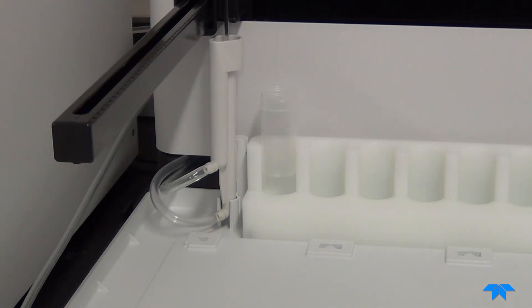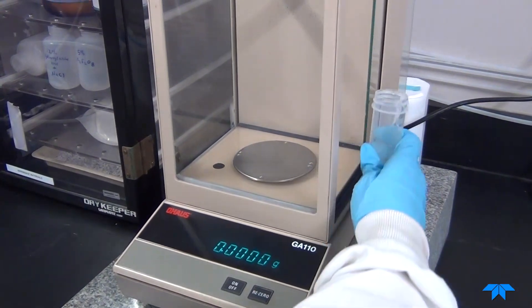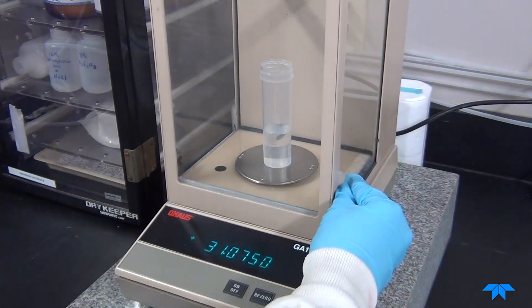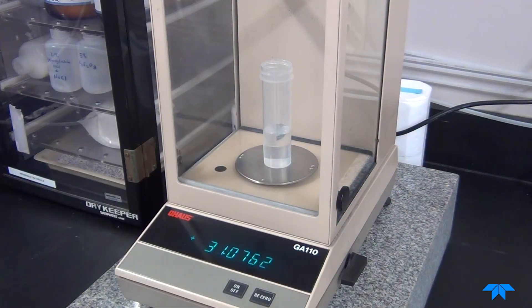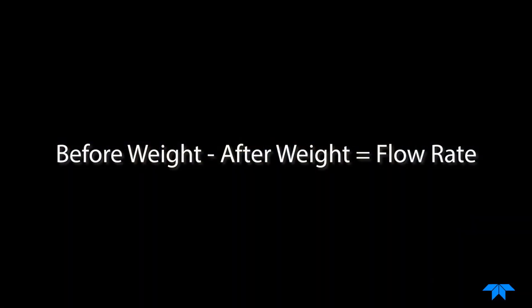Tare the balance. Then place the container on the balance, allow it to stabilize, and record the weight of the container. This is the after weight. To determine the volume uptake, subtract the after weight from the before weight.